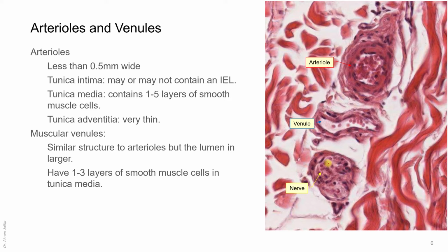And the nerve, you can see that it doesn't have a lumen. That's why here I'm saying that this is a nerve. And the nuclei of the cells here, make sure that these are not of neurons, because what's a nerve? It's a bundle of axons. So the neuron cell body is not present in the nerve. It's present somewhere else, either in the ganglion, or in the gray matter of the brain or in the spinal cord.